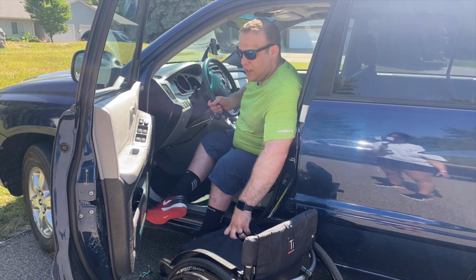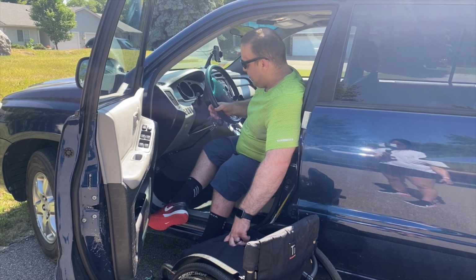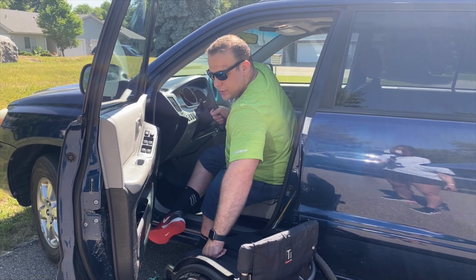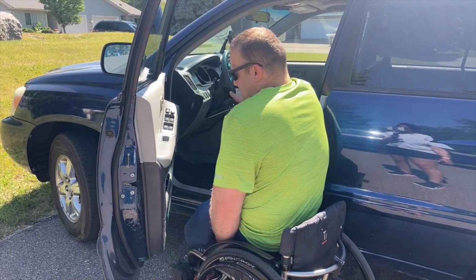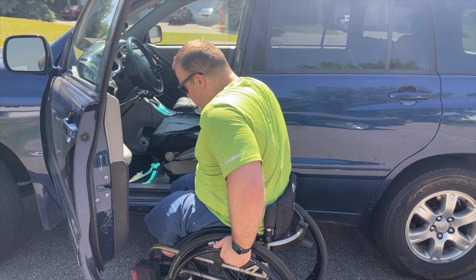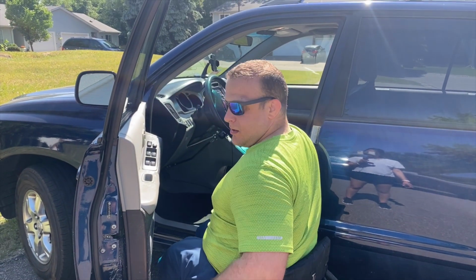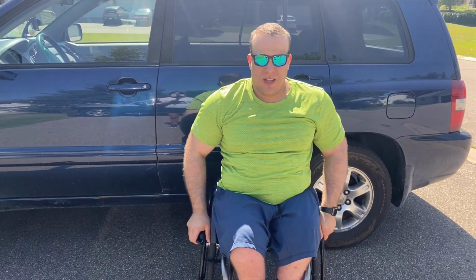And then for my transfer out, it's a little different. I don't put my hand on the seat. I suppose I could, I've never tried, but more often than not, I grab the steering wheel, and then one hand on the cushion, and then just let myself down, and I'm in, adjust my feet, and then I always throw my keys up in the dashboard so I don't have to reach back across over there, and we're good to go. So that's my pretty simple process for getting it out of my car.